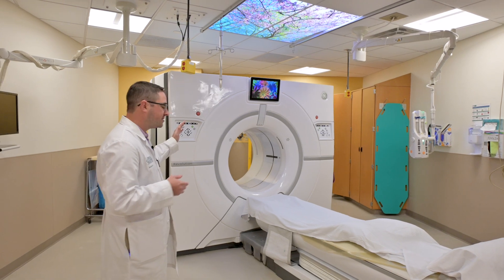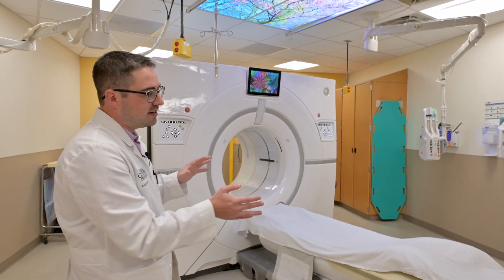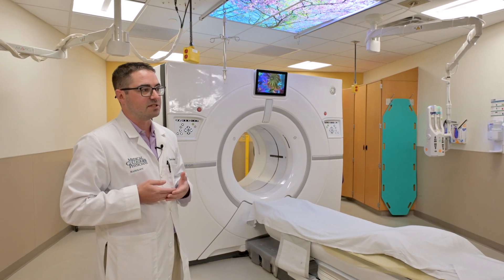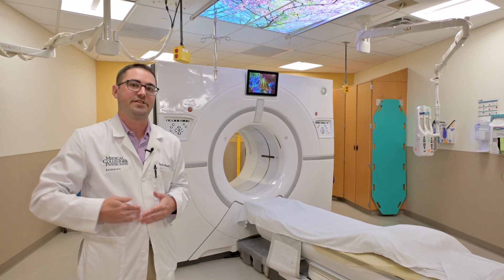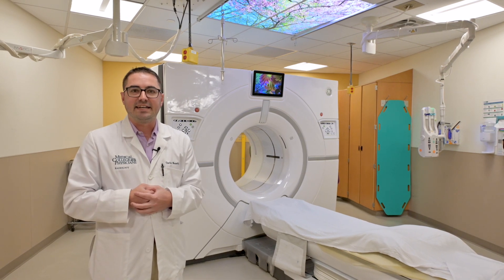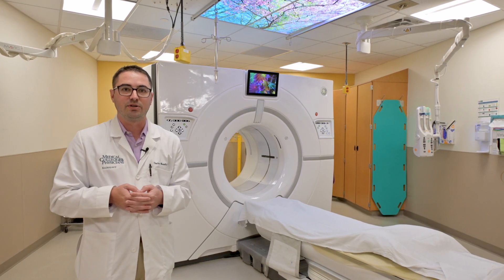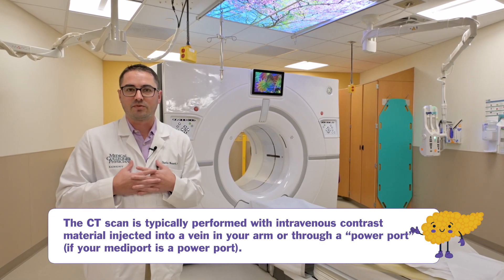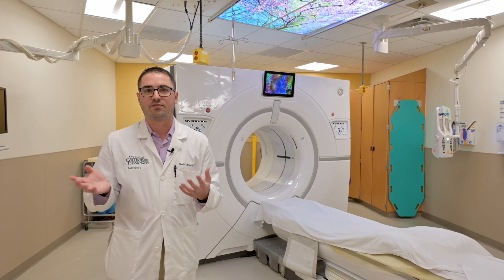The way it works is that we have detectors and radiation emitters that continuously spin at a very high speed as the patient travels head to toe into and out of the scanner. This acquires images in the axial plane, and then we post-process the images at a workstation outside the room that creates sagittal and coronal images for us as radiologists to look over cohesively to get the best picture of what's going on. In pancreatic cancer patients, it's often very important to look at the vasculature, so we inject contrast to delineate the arteries and veins being involved by the primary tumor, so we can relay how severe or insignificant that involvement is to the surgical oncologist for potential surgical planning.